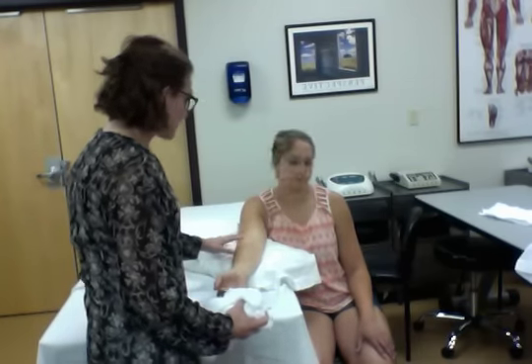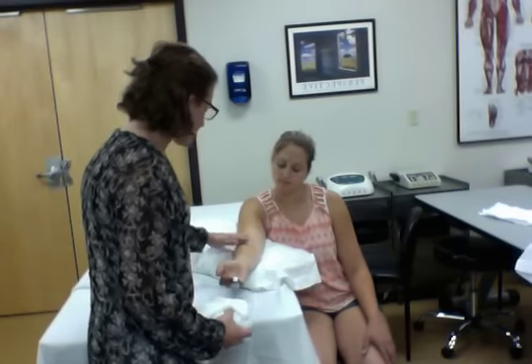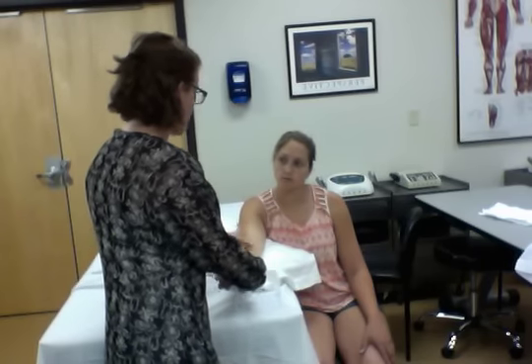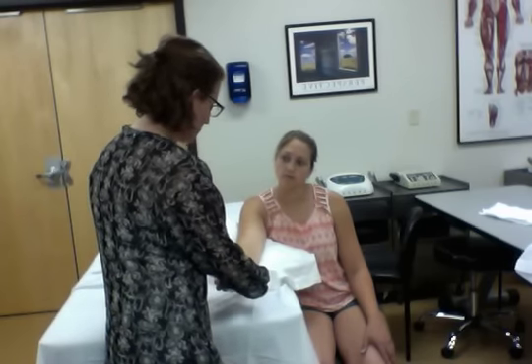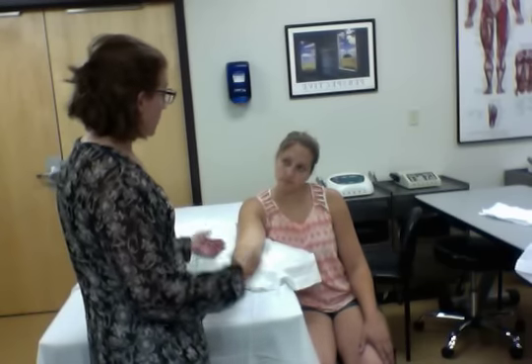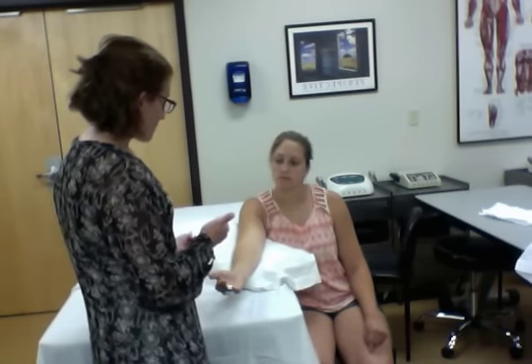Do you have any pain or discomfort in the area? Excellent. So your skin's a little bit red. That's normal because we warmed it up. And now what it would be a good idea for us to do is I'm going to do some soft tissue massage while you try and extend your elbow. Or really anything that would be trying to work on elbow extension would be appropriate after that treatment. And then we'd maybe talk about your home exercise program and so on.